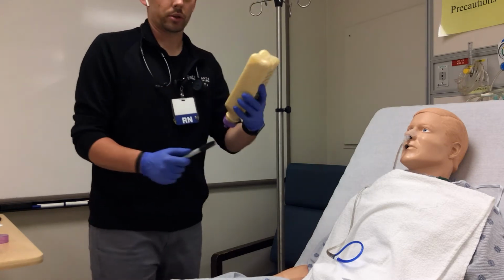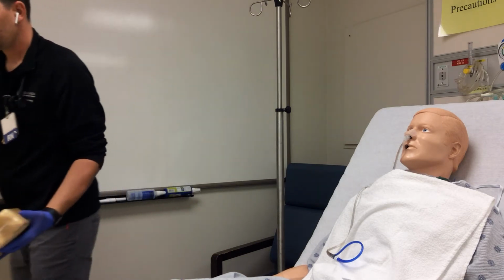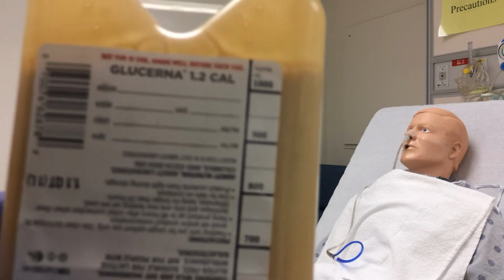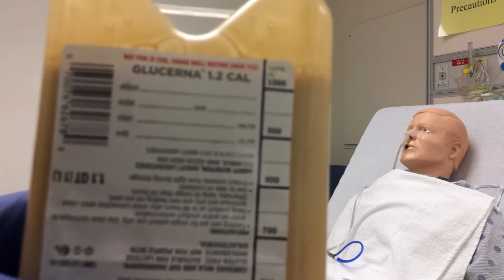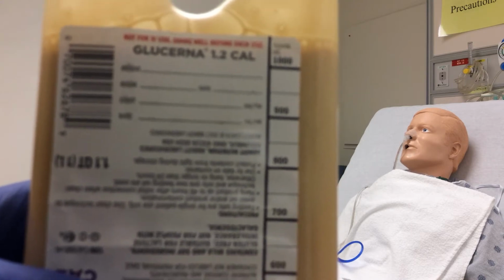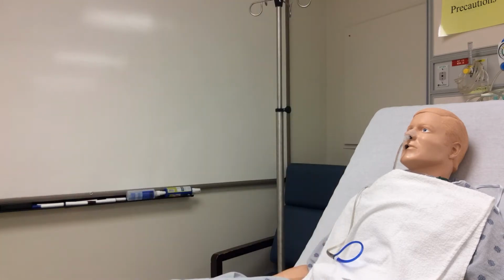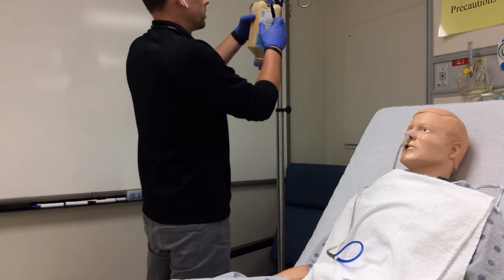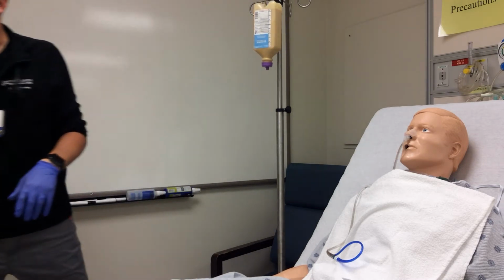If I can get you close to the camera here, you can see these tube feed bottles actually have a place to write that information on the top right. So if we write down the rate that it's supposed to be going, it's a good way for the oncoming nurse after we leave to make sure that it is going as ordered.